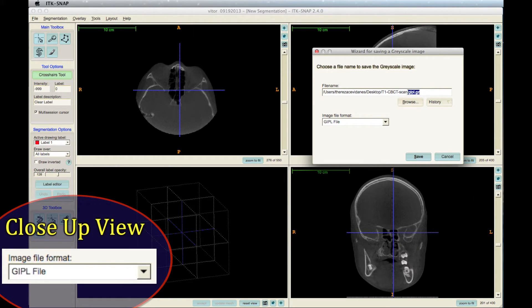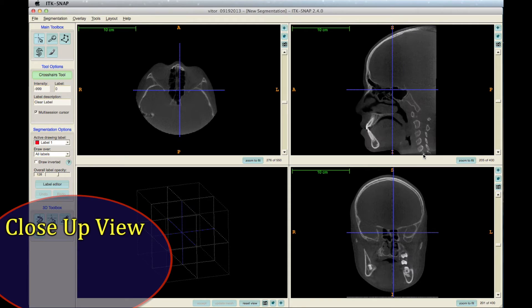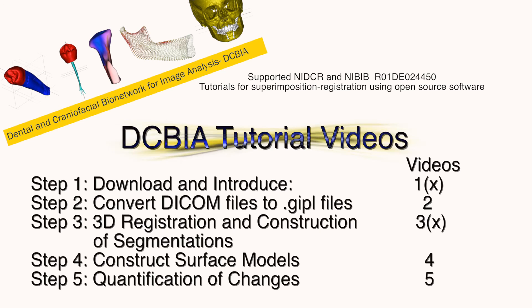Make sure the option selected for image file format is jipple, and then click Save. Now, the jipple file conversion is complete.